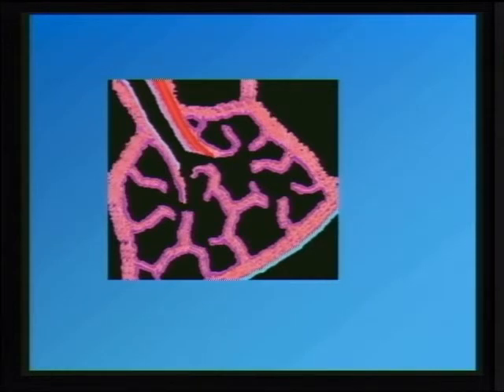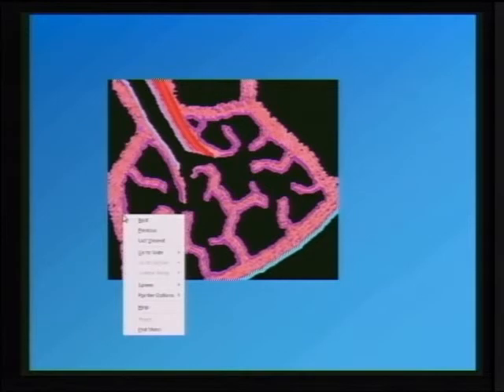So if I use again the model of the secondary pulmonary lobule, and look at how I recognize interstitial lung disease, I look at the anatomy of the secondary pulmonary lobule, and I look at the outlining supporting connective tissue. And then you can see here what I have depicted is the fact that the interlobular septa are much thicker than the normal appearance of an interlobular septum, which is going to be 1 millimeter or less.